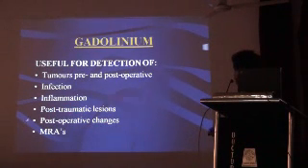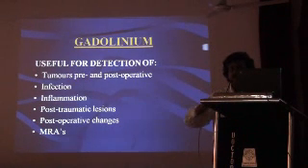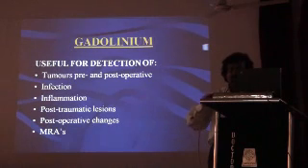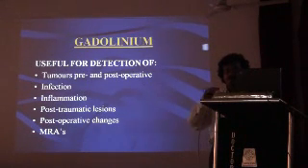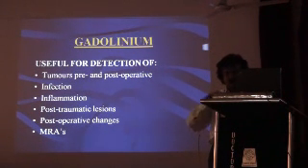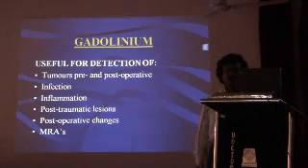For post-operative changes, gadolinium is useful because a post-operative scar or recurrence cannot be distinguished without the help of gadolinium. If there is post-operative residual scar, it will not enhance. If there is recurrence of tumor but you are not sure, put contrast, it will enhance.